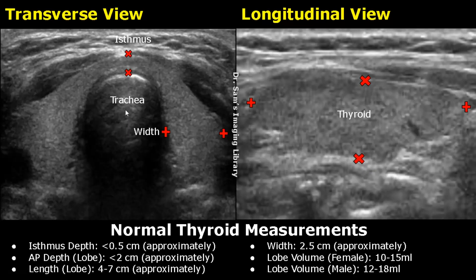This is the trachea. The depth of the isthmus can be measured in the transverse view by placing one caliper at the anterior margin of the isthmus and the second caliper at the posterior margin of the isthmus. The normal depth must be less than 0.5 cm.